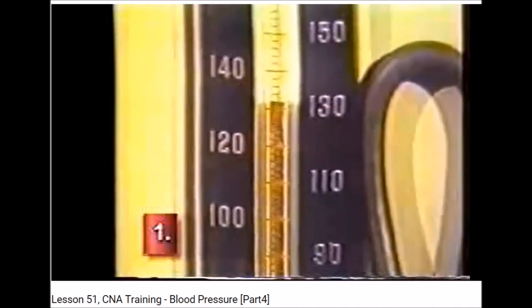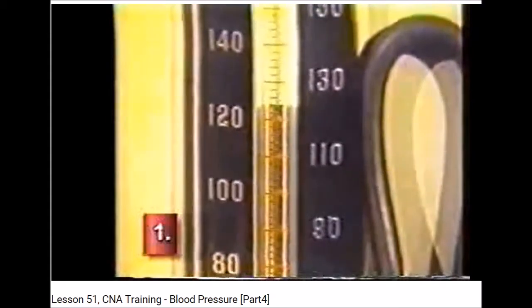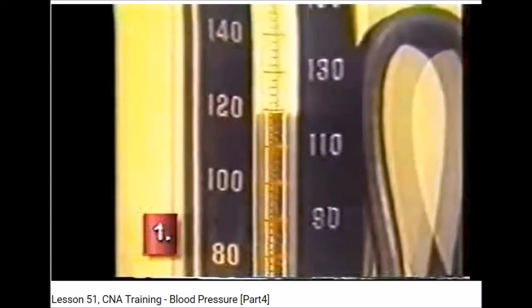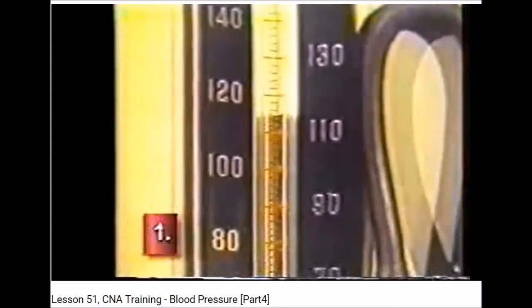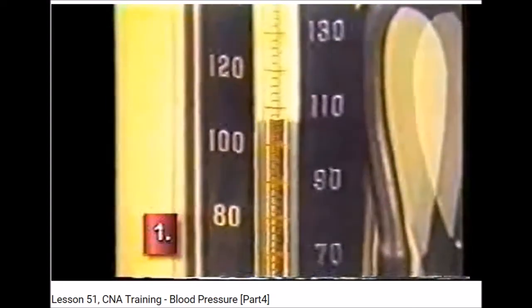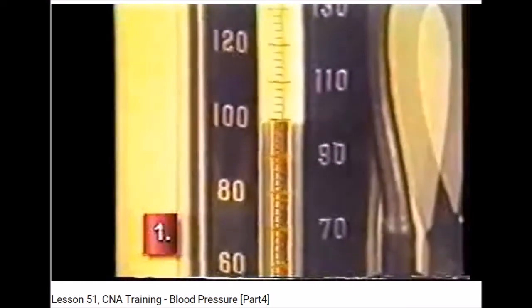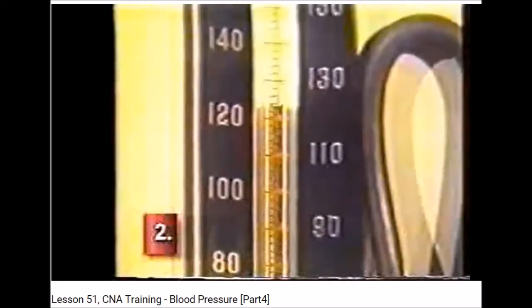You can hear the heartbeat. You're listening now for when the heartbeat disappears. And that will be the diastolic pressure, the low pressure. And there it is. You don't hear the heartbeat. So this lower number for this person was about 102 millimeters of mercury.